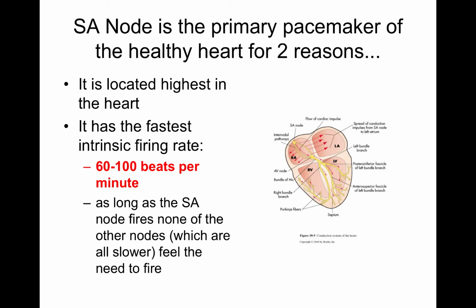So it's important that you know the normal limits of each of the nodes, because, for example, if it was sinus tachycardia, that is by clinical definition a sinus rhythm that is greater than 100 beats per minute. On the opposite side, if a rhythm is sinus bradycardia, by definition in clinical presentation, that will have a P wave and it will have a heart rate that you count less than 60 beats per minute.